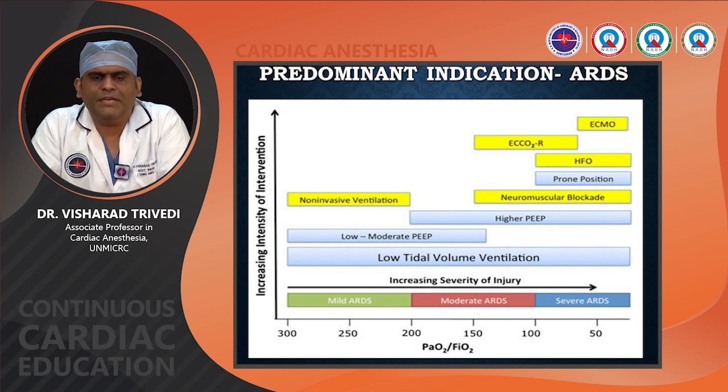you can say any respiratory complication where the patient is not maintaining gaseous exchange, you can use ECMO as a modality of gaseous exchange. So you can say that ECMO is actually a non-conventional method of ventilation only. But you have to follow the proper hierarchy or proper flow chart for management of that.